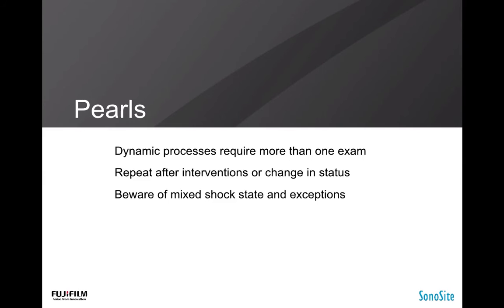Remember that patients may have a mixed picture, such as the CHF exacerbation who was also septic due to pneumonia. There are exceptions and special cases that you have to be aware of in order to use the RUSH exam to benefit your patients. Remember that if a patient is on a ventilator, positive pressure reverses the changes of the IVC, and in most patients will cause the IVC to become larger and less compliant, so that if significant change is seen during the respiratory cycle, the patient may benefit from volume.